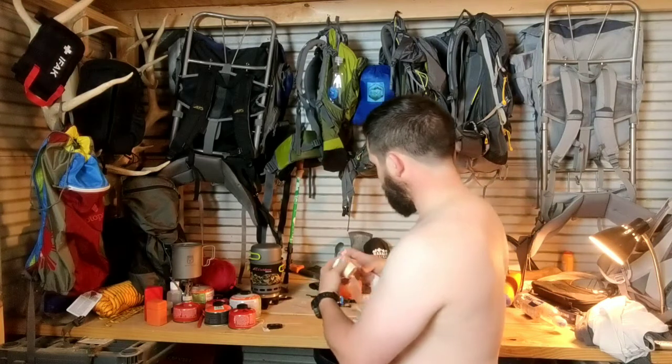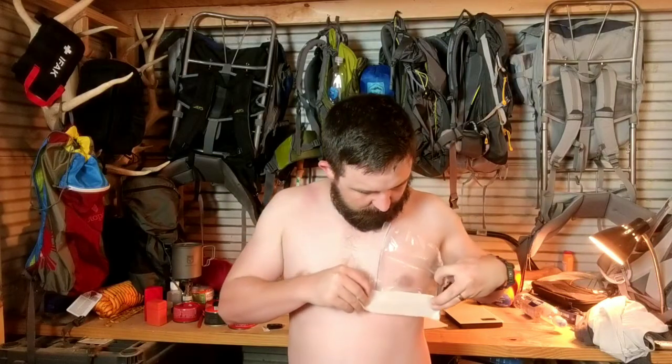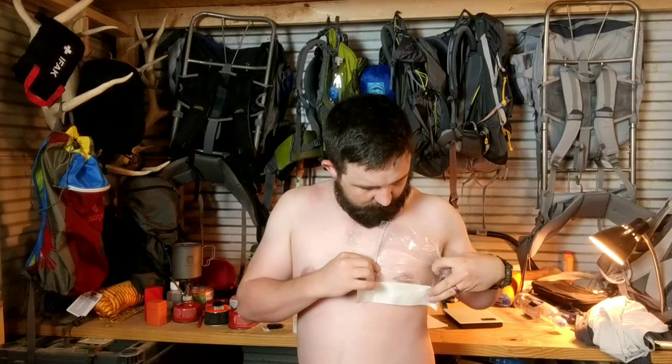What I mean by that is that in a situation like this, the wound's going to get all kinds of gross. And you're going to want to make sure that it has the opportunity to release some air. So let's say that the wound is right here, just above my nipple. We're going to put this so that a full inch or inch and a half around the wound is covered.